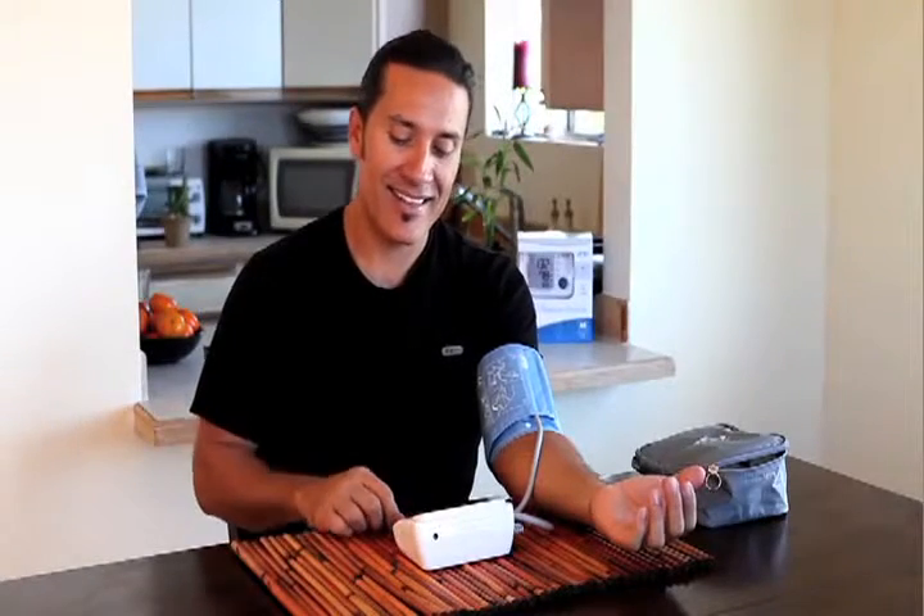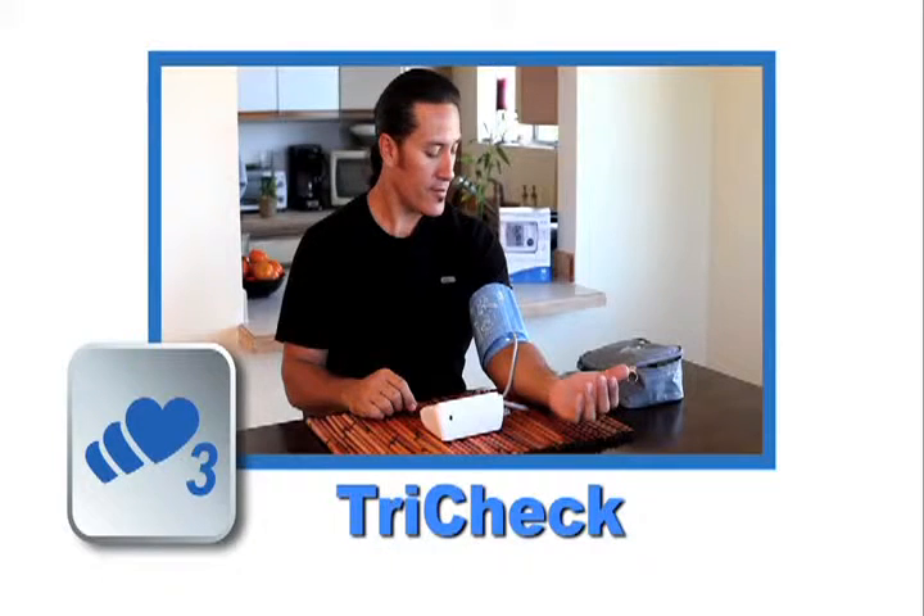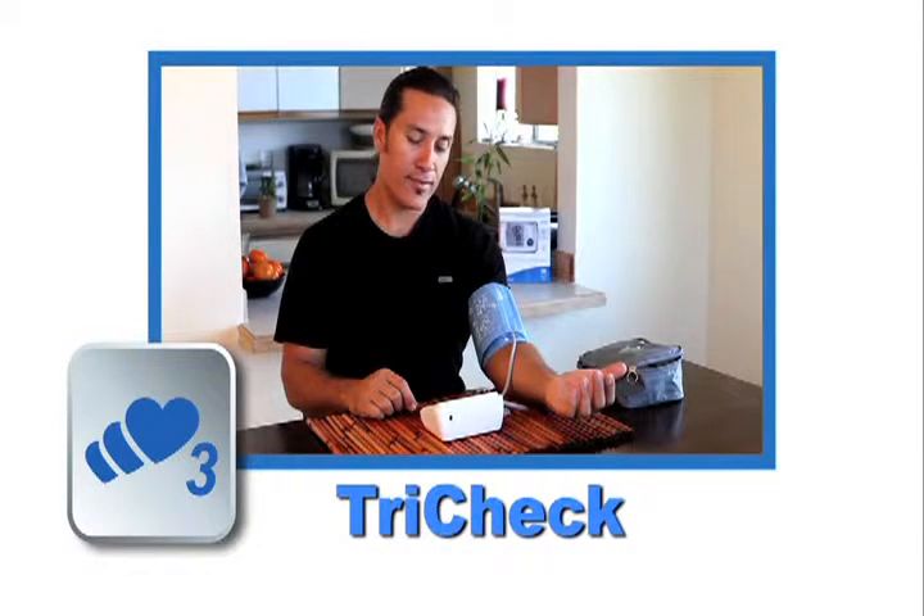Then press the clock button. The TriCheck mode will appear. TriCheck automatically takes three consecutive readings, one minute apart, and displays the average.